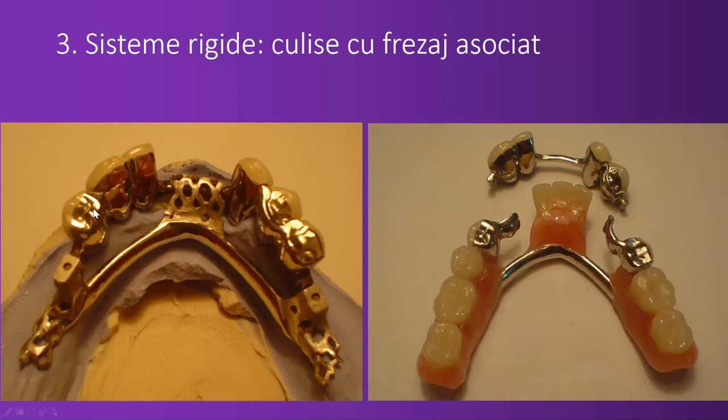You see that this first tooth of the denture has a ceramic covering, is very aesthetic, and it hides the attachment, and then it has a distal part where the pin, it's called the conjunctor, where we would adhesively cement the main connector. This is gone. This is history. It's absolutely history.